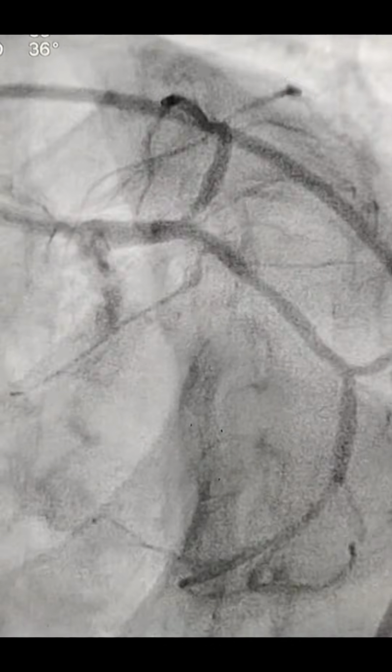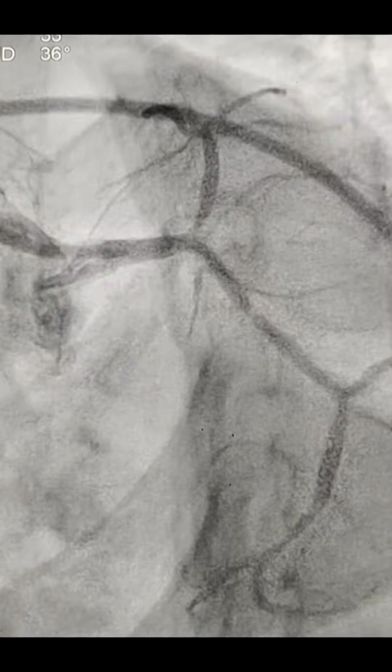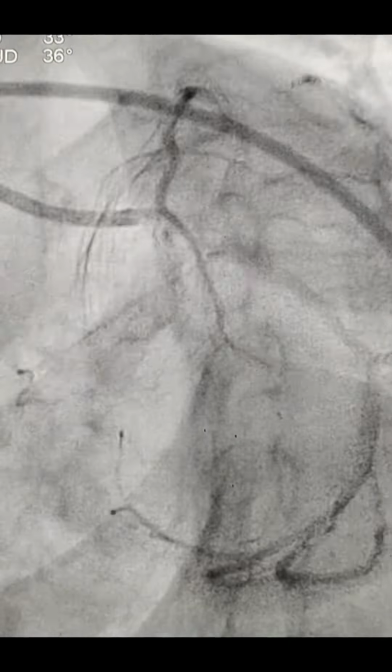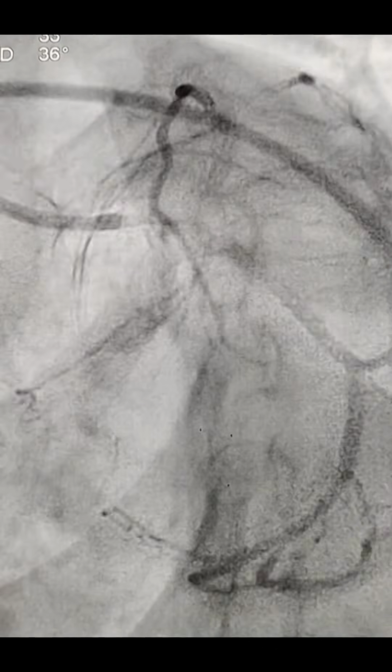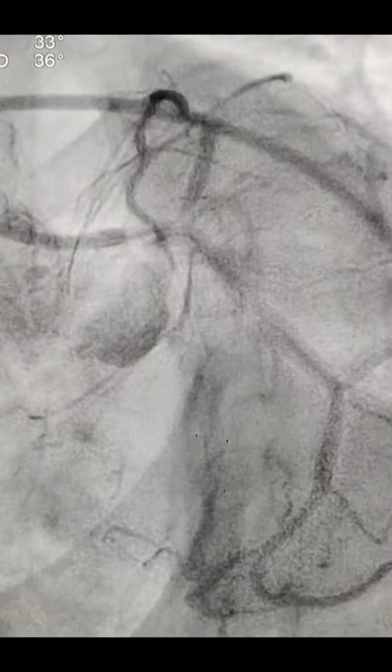So basically, to do the angioplasty of the ostial LAD, there are two techniques. One is nail the ostium, in which you keep the stent just at the ostium with 1 to 2 struts in the left main, that is a hanging stent. That is called the nail the ostium strategy, and there are advantages and disadvantages of the strategy. And the second strategy is LM to LAD. Generally in ACS cases, we used to do LM to LAD stenting in this thrombotic ostial LAD.